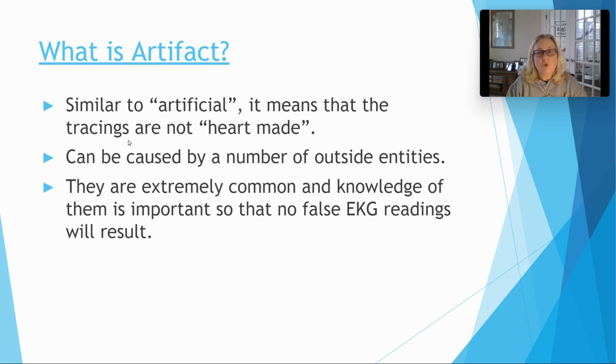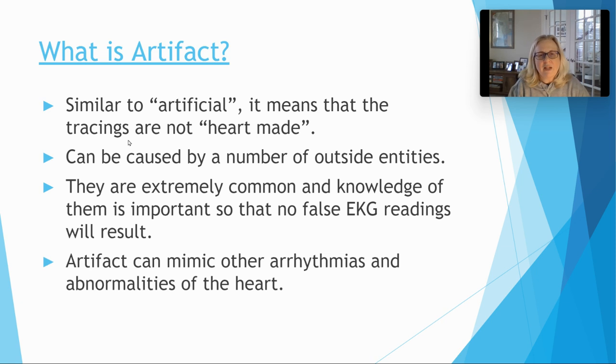I would suggest when you're doing your EKGs live that you hook up the patient first and then turn the machine on, because it allows the machine to kind of settle in while you're putting their information in. So their name and all that stuff, their date of birth and all that, while you're putting it in, it's allowing the EKG to just kind of settle itself in. Settling in is one of the causes of it getting artifacts. So we'll get to that in a second here. They can mimic other things like arrhythmias and AFib and things like that. So if you're not careful, you have to make sure that it's the difference between that and just being artifact. Okay.